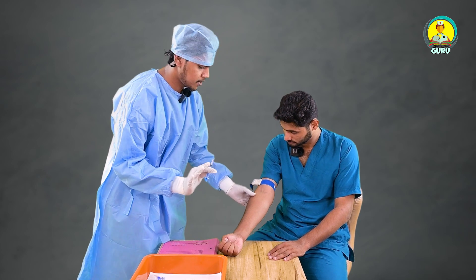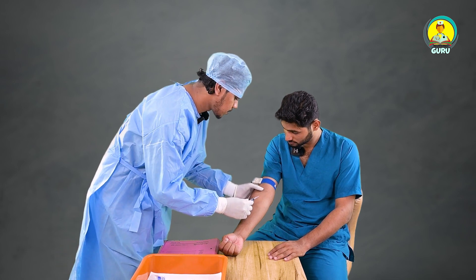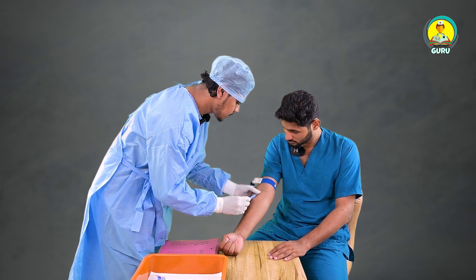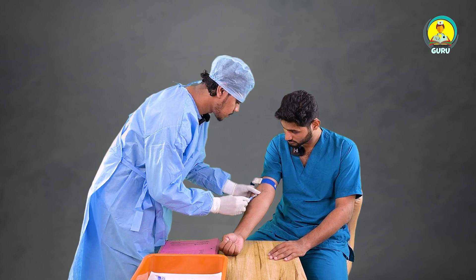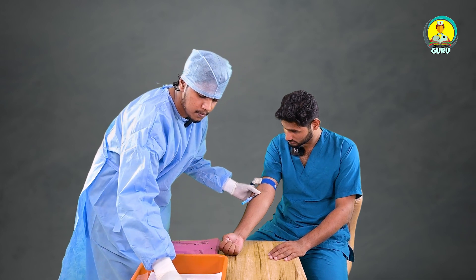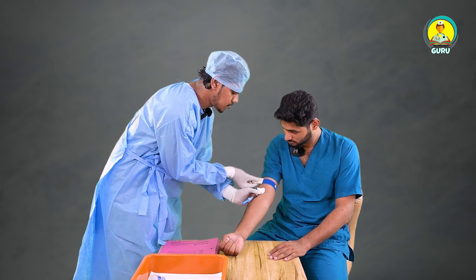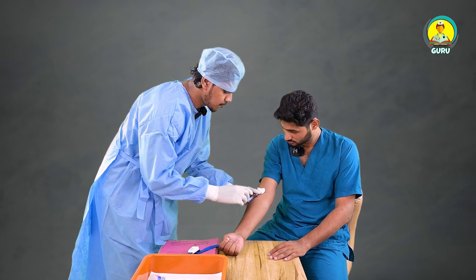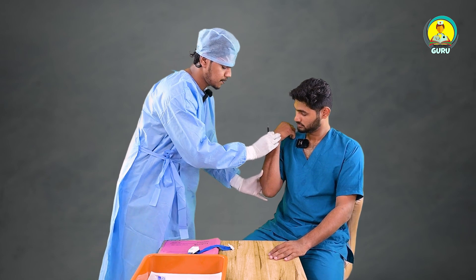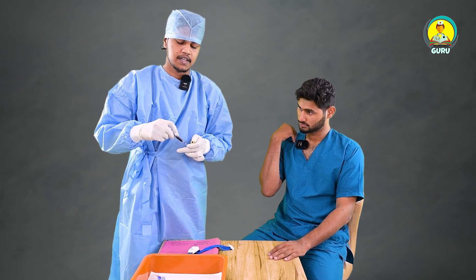Sit freely, it's just a small prick. Okay. Put a dry cotton over here and release the tourniquet. Hold your hands tight. And we need to collect it in a container.